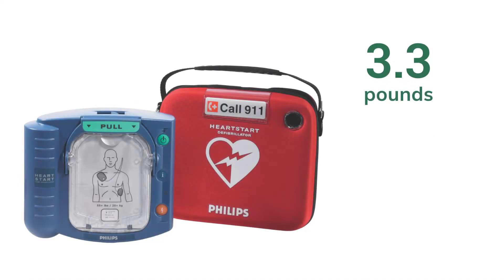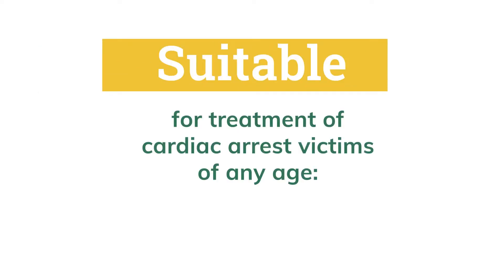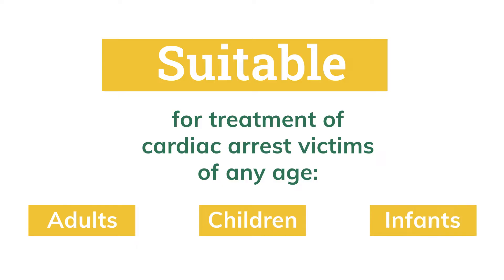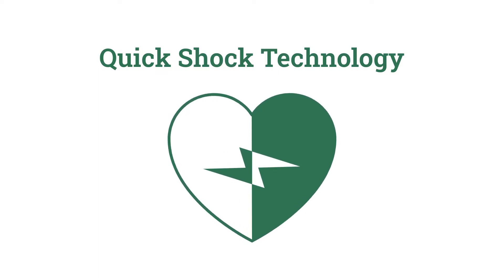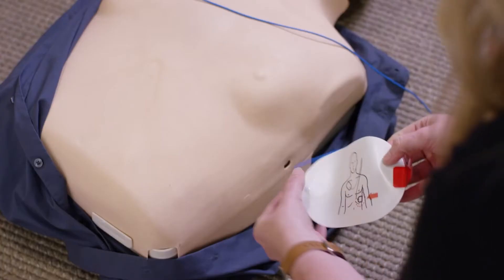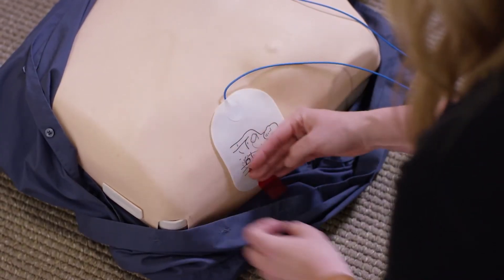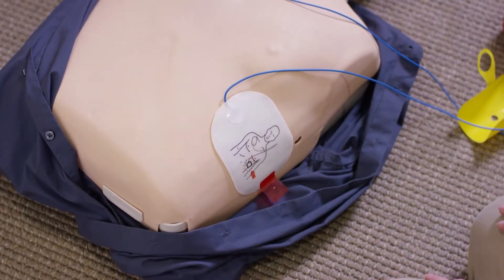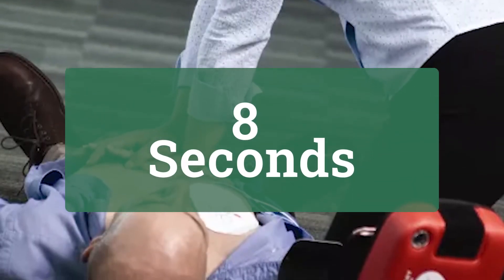At just 3.3 pounds, the device is light enough to be deployed quickly by almost anybody and is suitable for treatment of cardiac arrest in victims of any age, including adults, children, and even infants. The HeartStart Home AED uses Philips' patented quick shock technology to minimize chest compression interruptions, and the device's smart pads sense application to the patient's skin to intuitively align with the response process. A shock is typically delivered just 8 seconds after CPR.